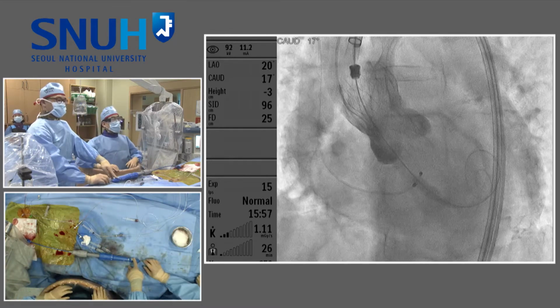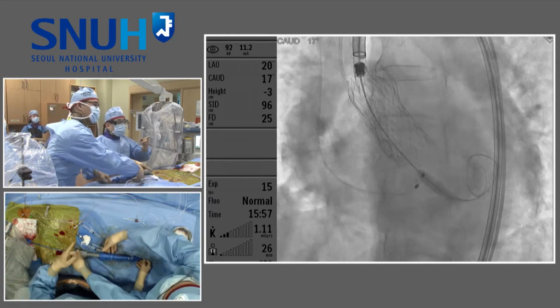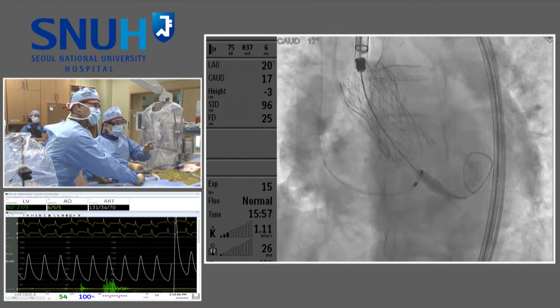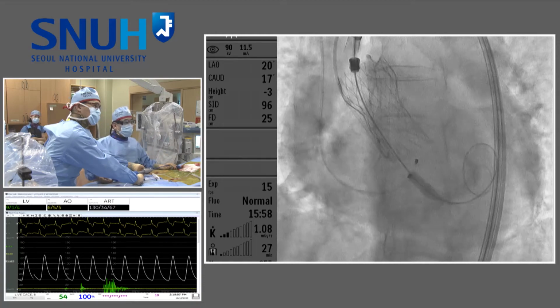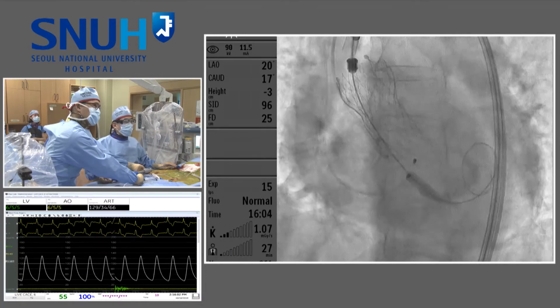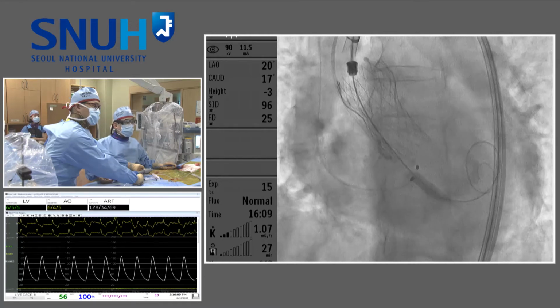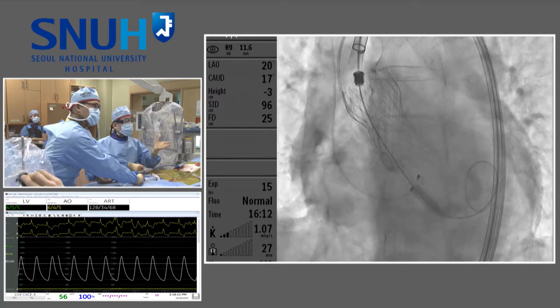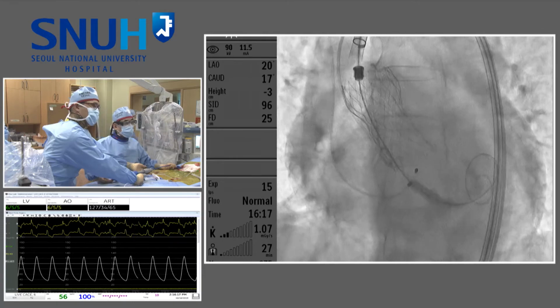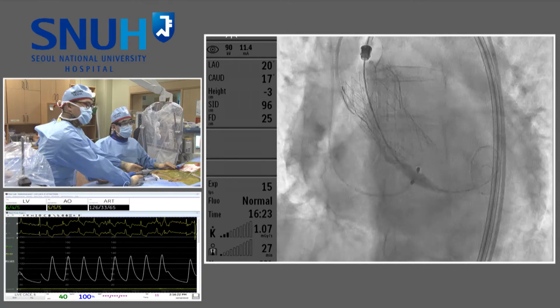Okay. Beautiful implantation. Then I retrieve the nose cone. It is very critical because, unfortunately, the proximal part of the nose cone is abrupt, not a smooth shape. I have one case of valve distal migration while retrieving the nose cone. Especially in that case, there was an expansion of the non-coronary side. Thus, when we retrieve the nose cone, we have to avoid touching the nose cone to the valve frame on the non-coronary side, like this.